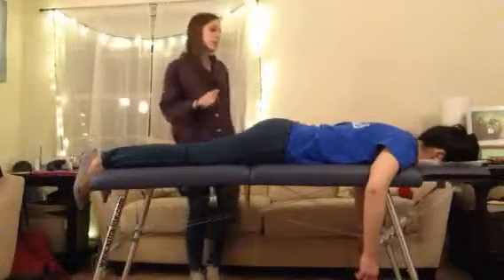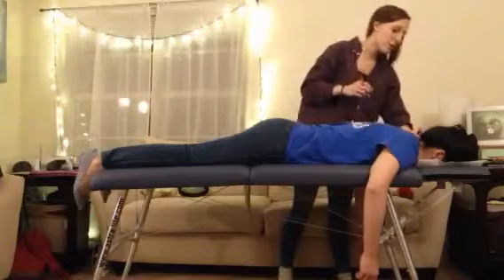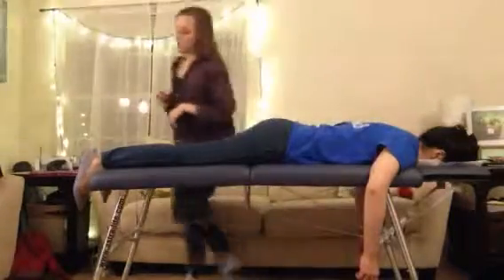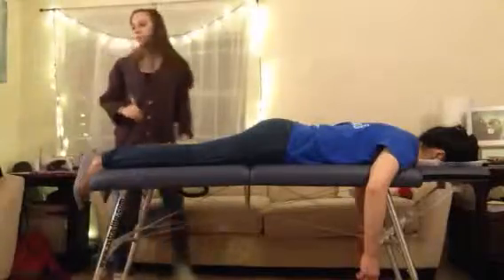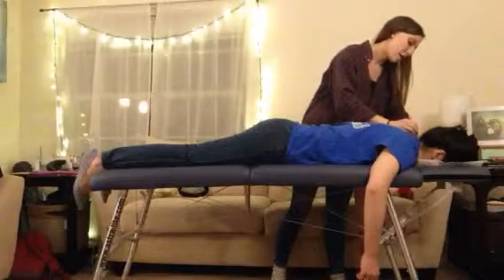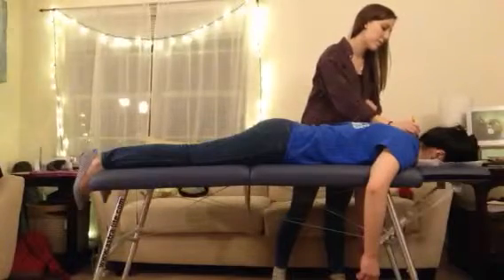We're going to check for C1, C5 posteriority on the side of short leg. So we're going to go to C1 and we're going to test the posterior TP, just straight P to A, and then check the legs. Okay. And then we would check for torque, either right or left. Whatever corrected, we'd use the integrator posterior to anterior at the posterior TP of C1.